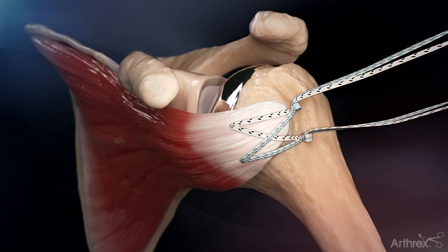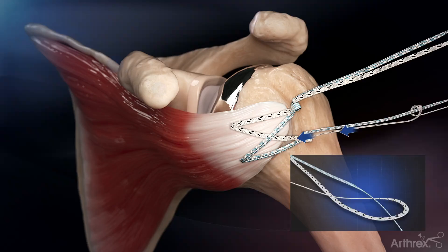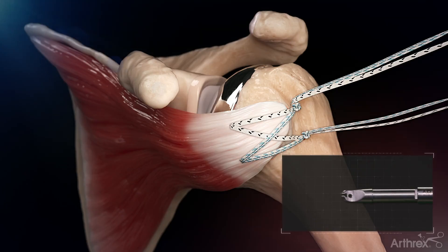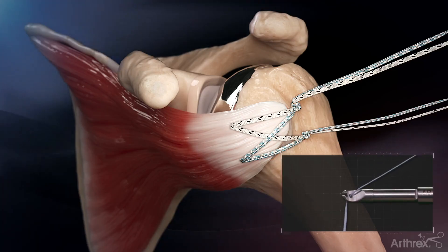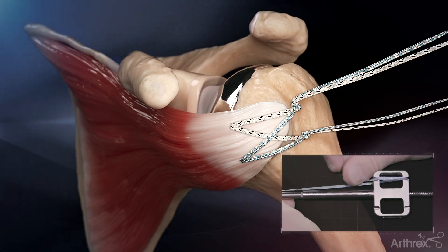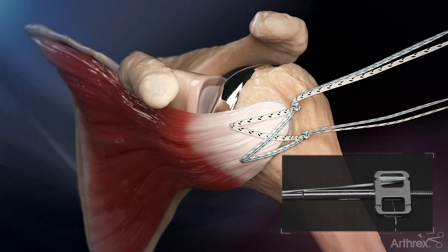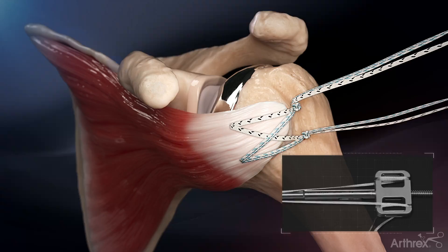Hand tensioning should be performed alternately between the superior and inferior knots. A half hitch is then tied over the inferior racking hitch knot. The superior suture limbs are loaded through the tip of the suture tensioner, passed around the paddle and cleated securely. The suture tensioner handle is then rotated clockwise until adequate suture tensioning is achieved.